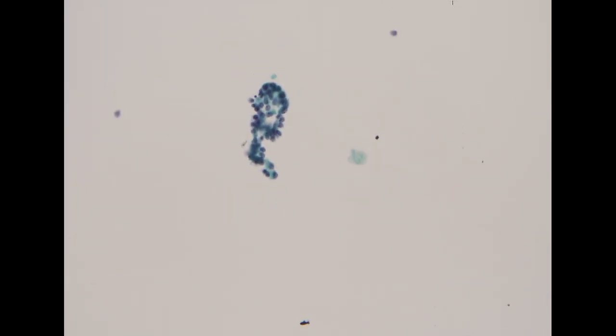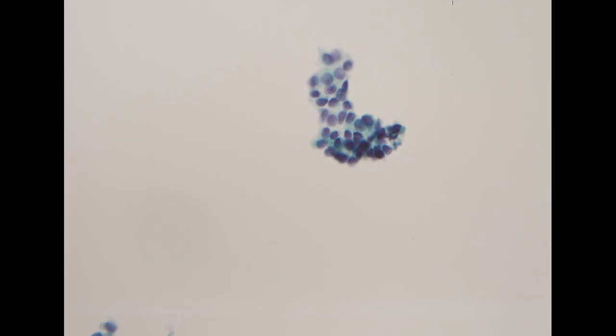So for this specimen, it is less cellular, but it still maintains some architecture as well as the nuclear features of PTC. So even though on low power we suspect it is a follicular neoplasm, however, when we go to higher power and we check the cytologic feature, it's compatible with papillary thyroid carcinoma. And we just need to find some pseudo inclusion. I think I find it somewhere, but yeah, here there is one. Okay, you see a pseudo inclusion over here. Okay, so this is also a papillary thyroid carcinoma.